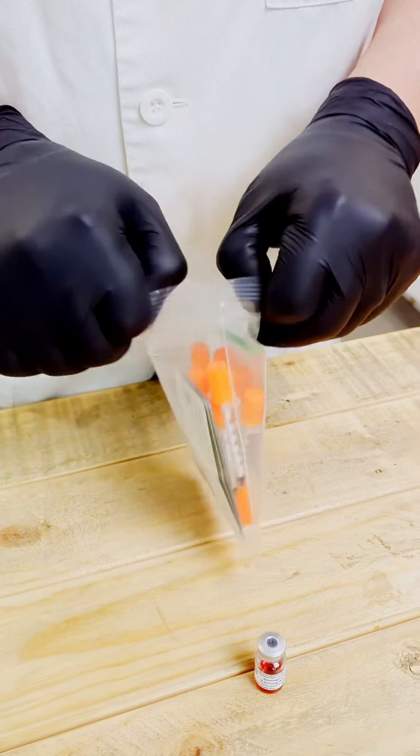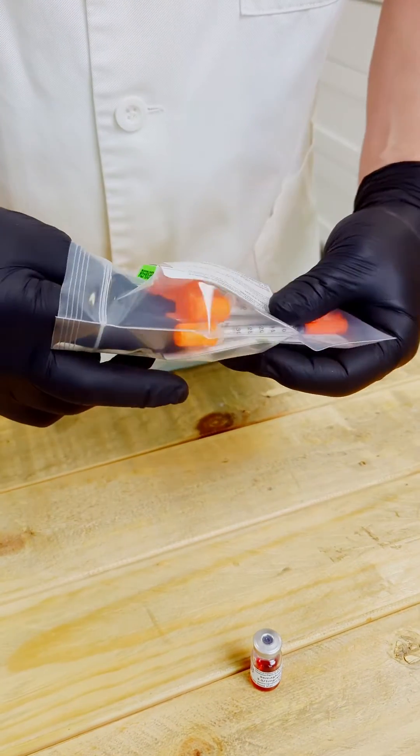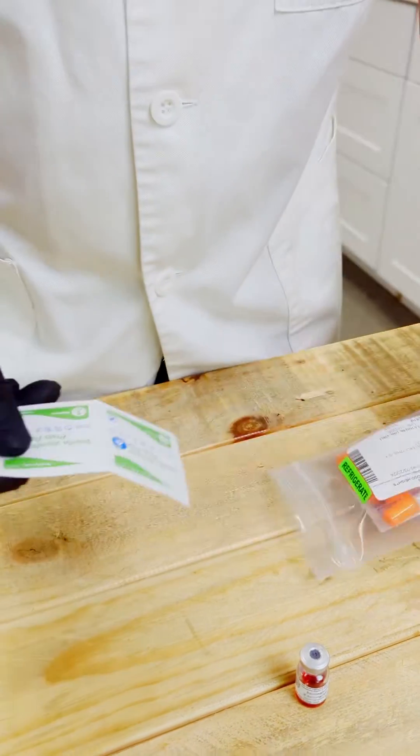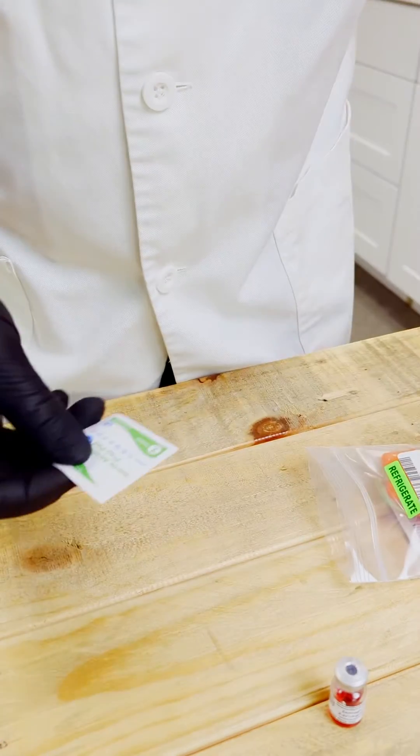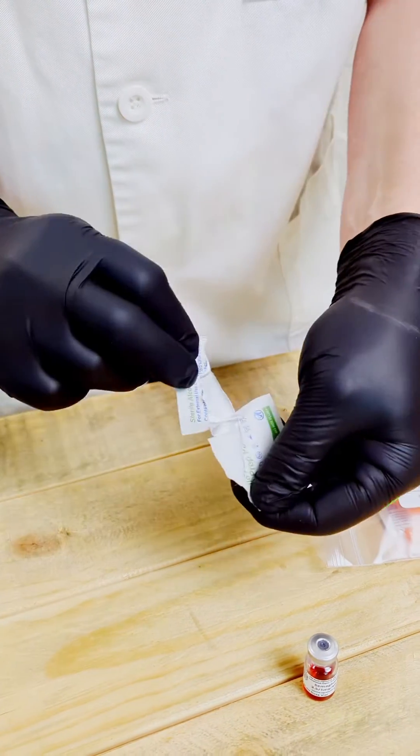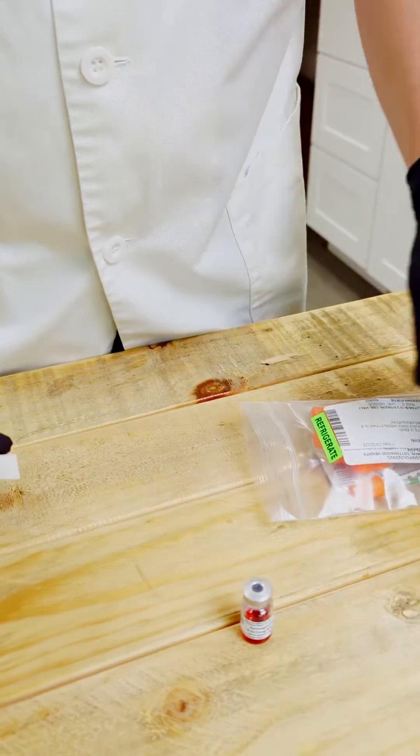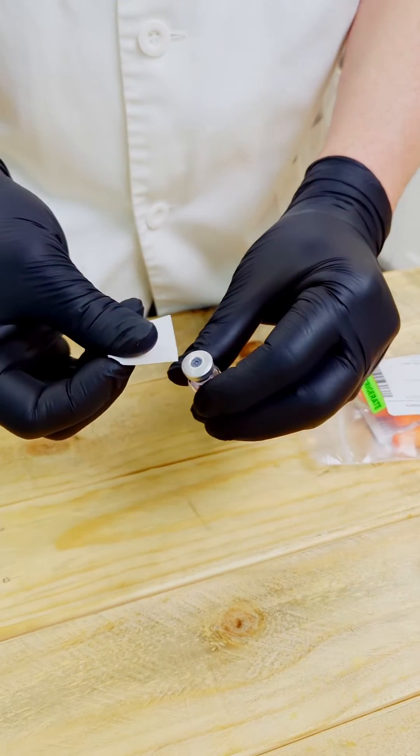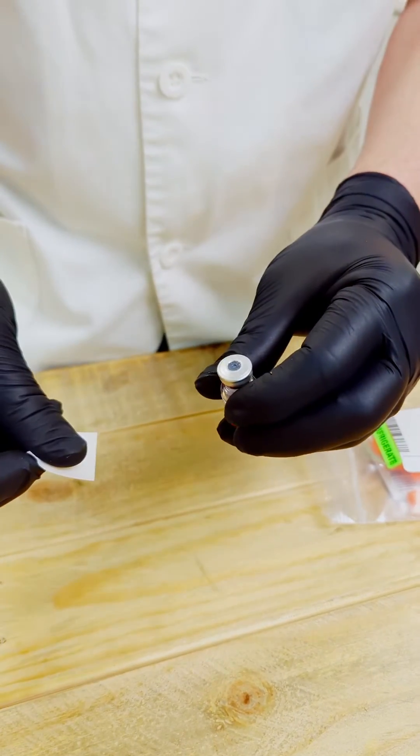We want to open the bag like so. And we will get an alcohol pad out of here. And then we always want to wipe the vial in one direction at least three times.